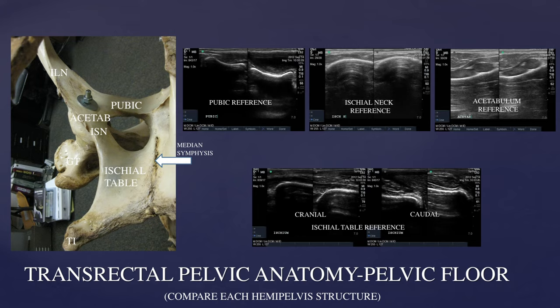Slide one demonstrates the normal transrectal pelvic floor anatomy. The anatomical specimen is on the left-hand side of this slide and shows the appearance of the ischial table and of the median symphysis — demonstrating only a hemipelvis, one half, the left-hand side. The bottom ultrasound images show both the cranial and caudal aspects of the right and left ischial table. These are normal reference images showing the curve of bone as they go over the brim of that structure, both cranially and caudally.